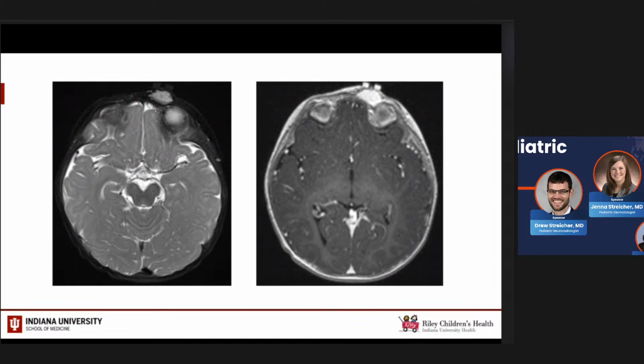When we think about a vascular lesion, a differential from an imaging standpoint, we want to think about a venous malformation. Usually not as much of a dilemma for the clinician, like Jenna's saying, they usually have a pretty good sense of what's going on. But for us, it's like, okay, there's this enhancing lesion and I think it's vascular. What do I think it is? Venous malformations can be more lobulated, they're less defined, more likely to be transspatial. The enhancement isn't as avid. It has more of a puddled pattern of enhancement.